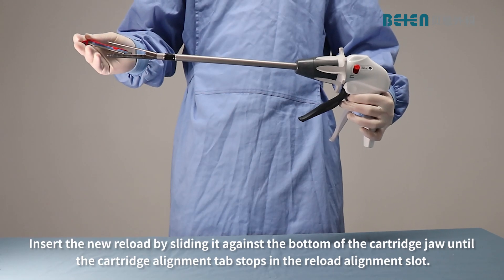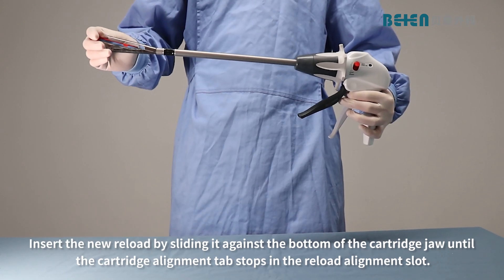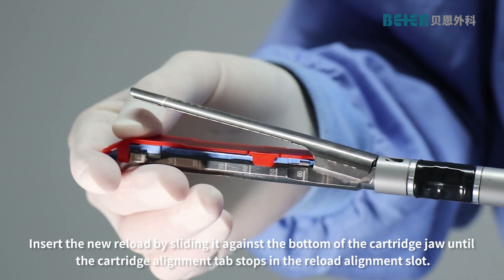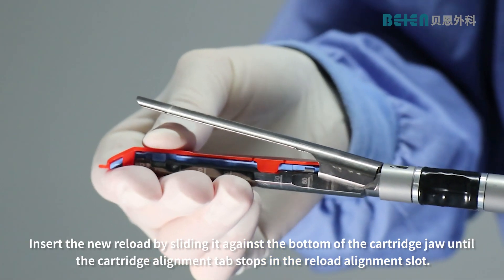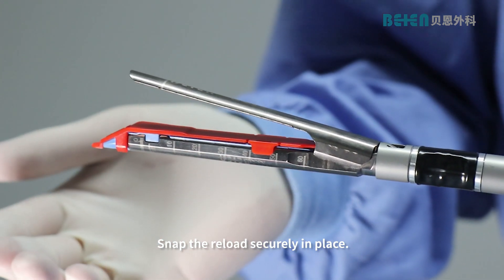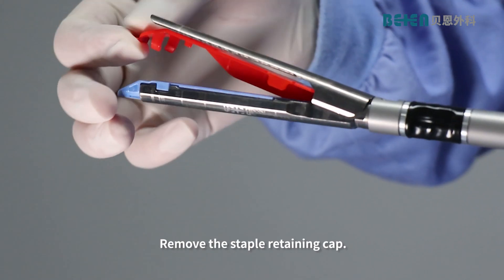Insert the new reload by sliding it against the bottom of the cartridge jaw until the cartridge alignment tab stops in the reload alignment slot. Snap the reload securely in place. Remove the staple retaining tab.